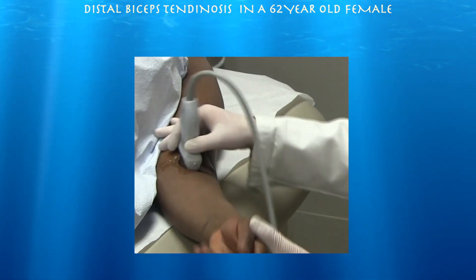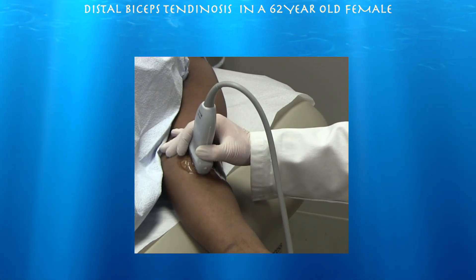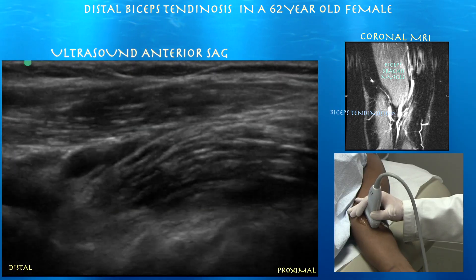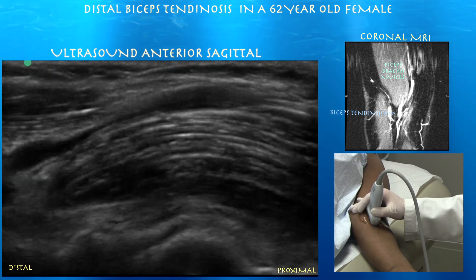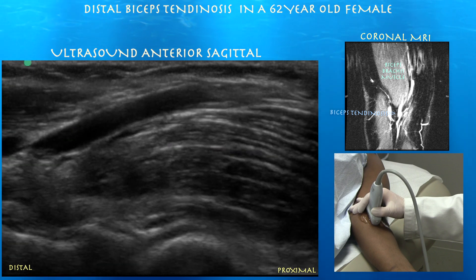I'm going to do a medial approach, basically using the brachial artery as an acoustic window. Here we can see the brachial vasculature. At this level I'm calling it the radial artery since we're right over the radial head where you would not expect the brachial artery; however, as you go proximal you would expect to find the brachial artery.